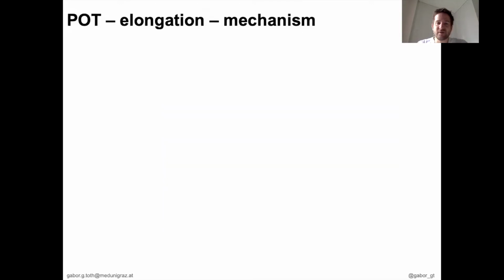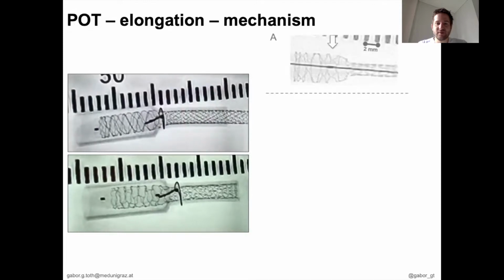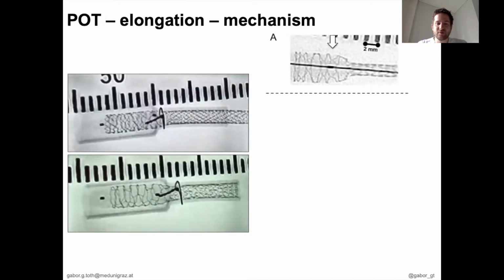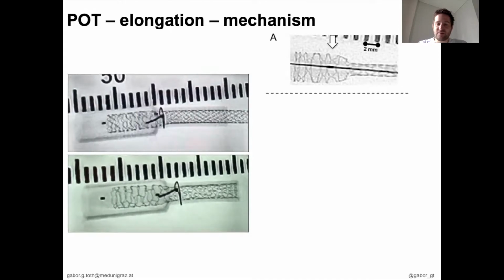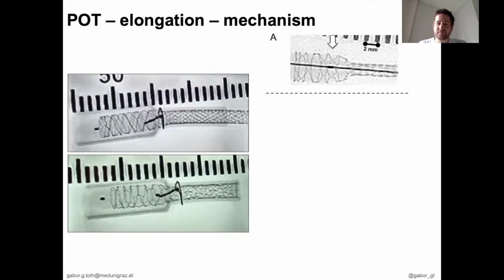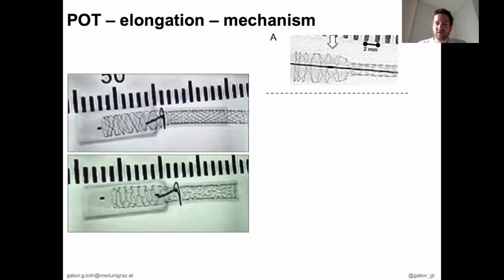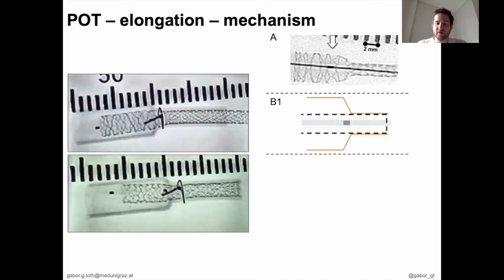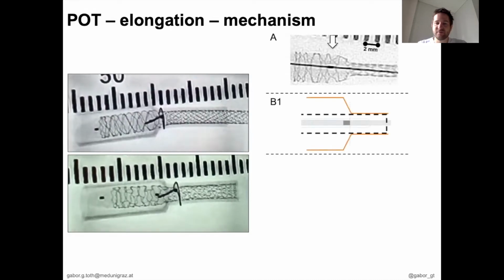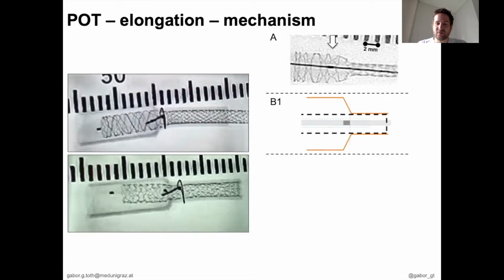Where does this elongation come from? Our observations suggest that this elongation comes partially from the POT balloon itself. Namely, there is a marked conical tip distal to the distal marker of the balloon, meaning that the proper carinal position of the marker ends with overexpansion within the daughter branch ostium.